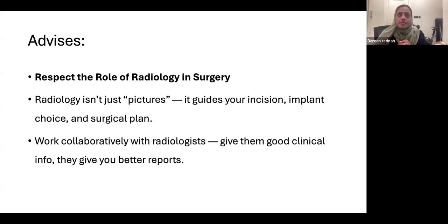Sometimes I see some fellows or residents write "35 years old with a fractured tibia." Okay, do you suspect intra-articular extension or not? Was there a dislocation before or not? Put in the details so the radiologist will give you a good report based on your details. Sometimes there is a 32 years old female patient without mentioning the fracture. Where is it? If the fracture is, like, a third toe fracture, they don't write suspected third toe fracture. The radiologist will look at every toe and will assume that you mentioned the third toe fracture.